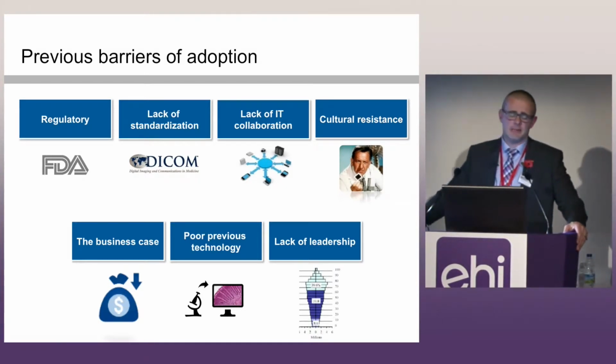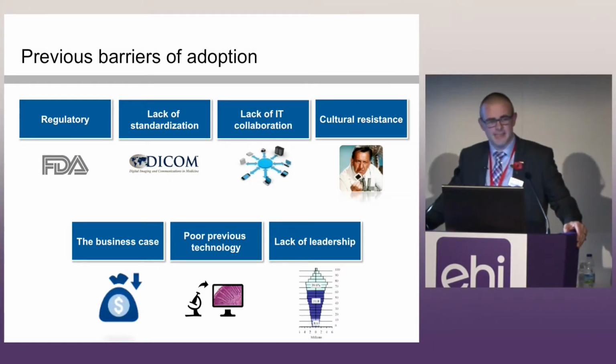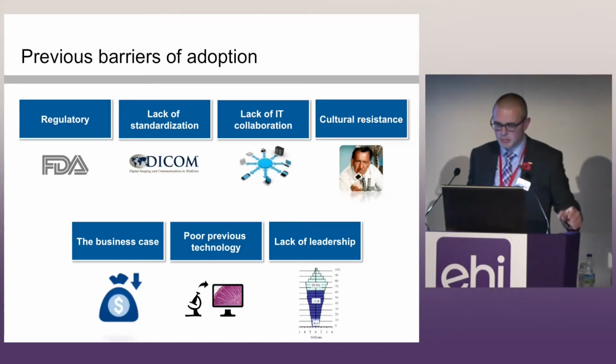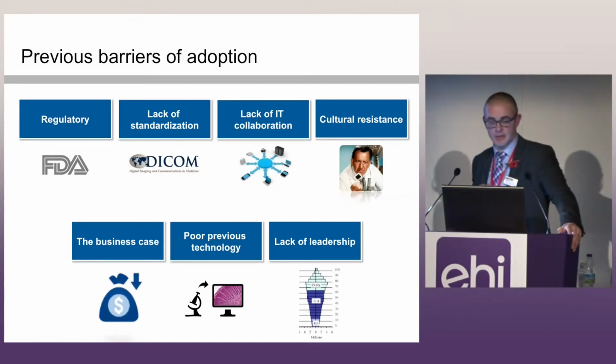And the final barrier there is the lack of leadership. That's not to say that pathologists aren't interested in driving their profession forward. They absolutely are. However, it is an aging profession with fewer and fewer younger pathologists entering the profession. Therefore, the guys that are involved are pretty much maxed out, and there's a shortage of people to draw from. So, in a nutshell, that's, I think, why the technology hasn't been adopted quite so widespread just yet. But I think, as I say, we're right at that tipping point.